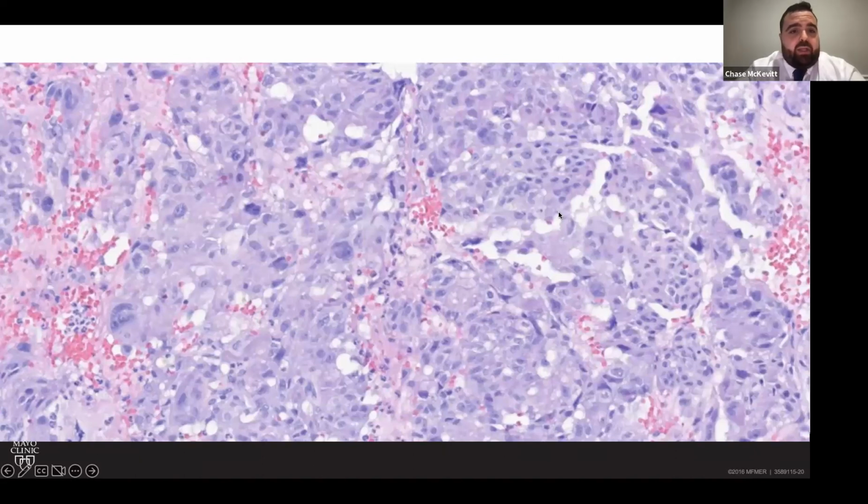Here he was talking about how this is unusual, as these cells display some nuclear atypia, which is unusual for pituitary adenomas. However, it didn't change the overall grade of the tumor, as the Ki-67 staining was still less than normal. So he just noted that this was unusual for a macroadenoma with this nuclear atypia.